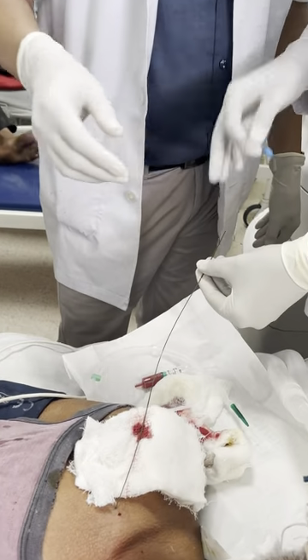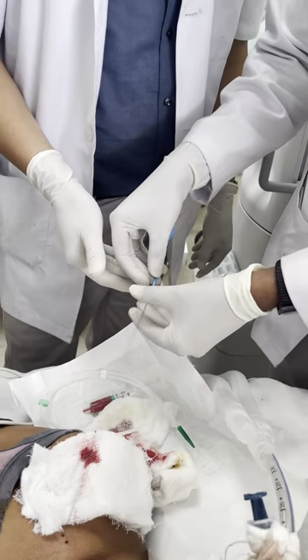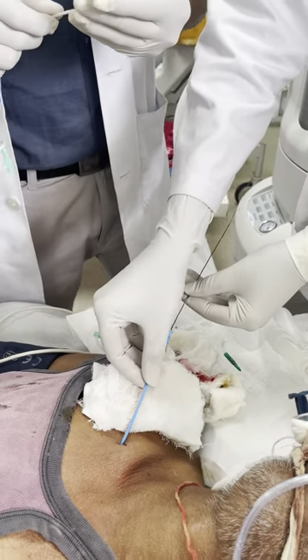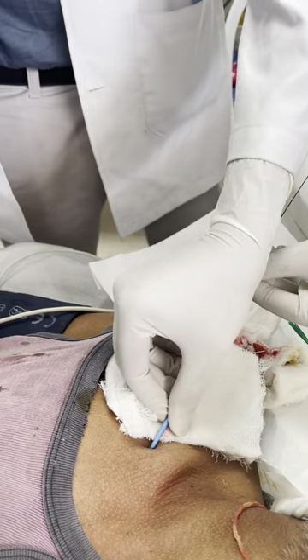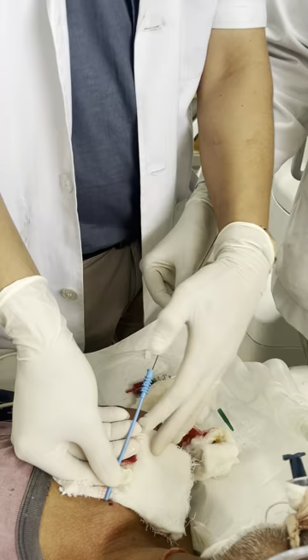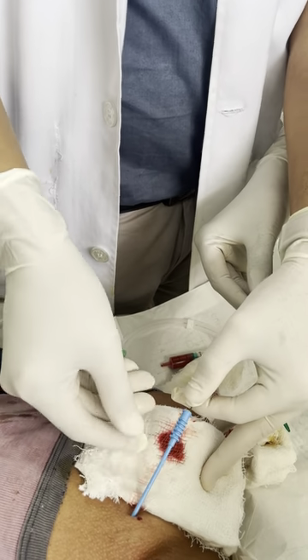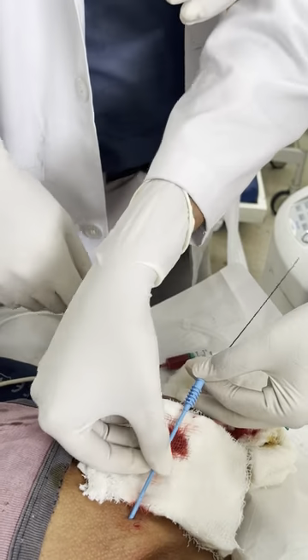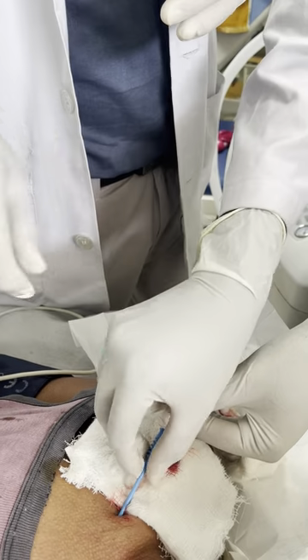Now dilate it. Good. Go. Since we have created a new bevel, we have to dilate it very well. We don't have this smooth, so dilate it properly. To dilate, holding this, you have to hold it as near as possible, like this. You have to push it like a man, not like a kid. It won't go like this. So do it again by your own hand. No, don't hold, hold it here. Otherwise it will get tilted and it will not work. Good enough. And rotate it.